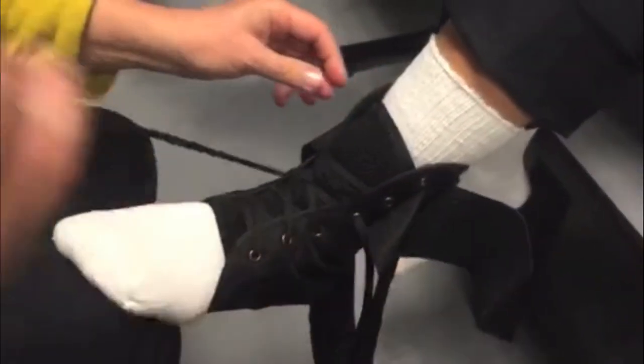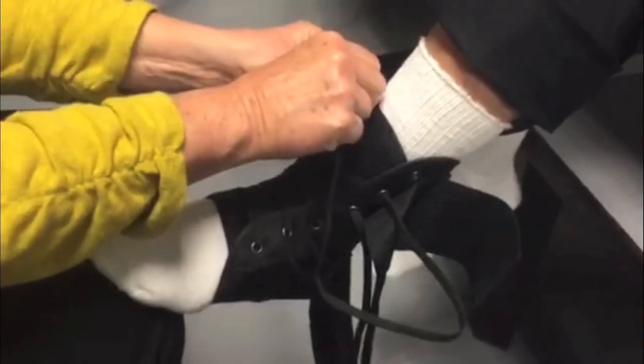Open the brace and slide the foot in, making sure to seat the heel in the rear opening of the brace. Start lacing at the toe and work your way up.